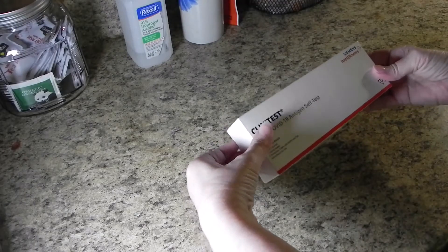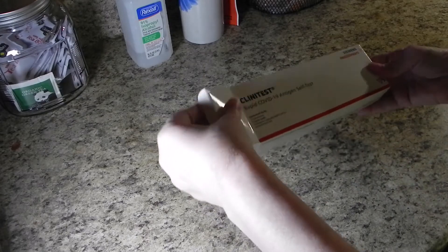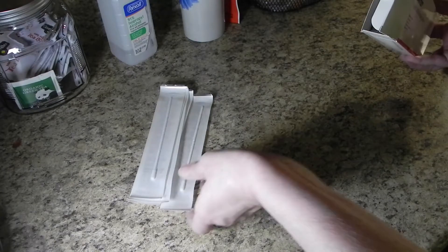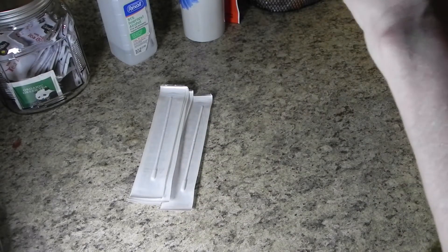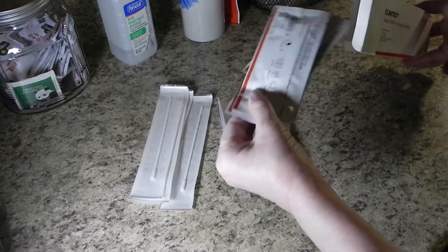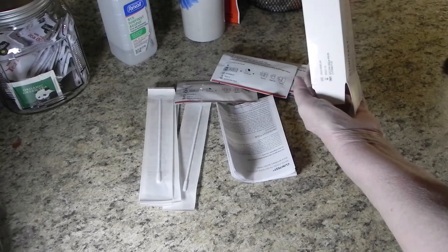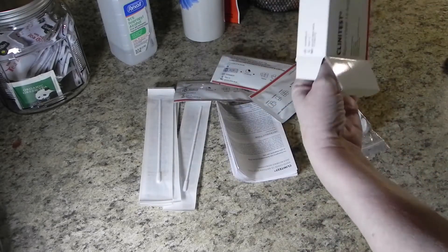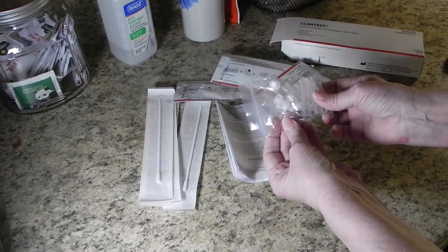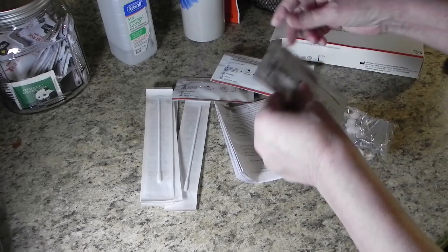Once you've gotten your area cleaned, it's time to unpack your box. Go through the items and make sure you have everything you need. There will be five of each thing, including your instructions. You'll have cartridges in plastic bags and long Q-tips. You'll also have a bag full of tubes and caps.